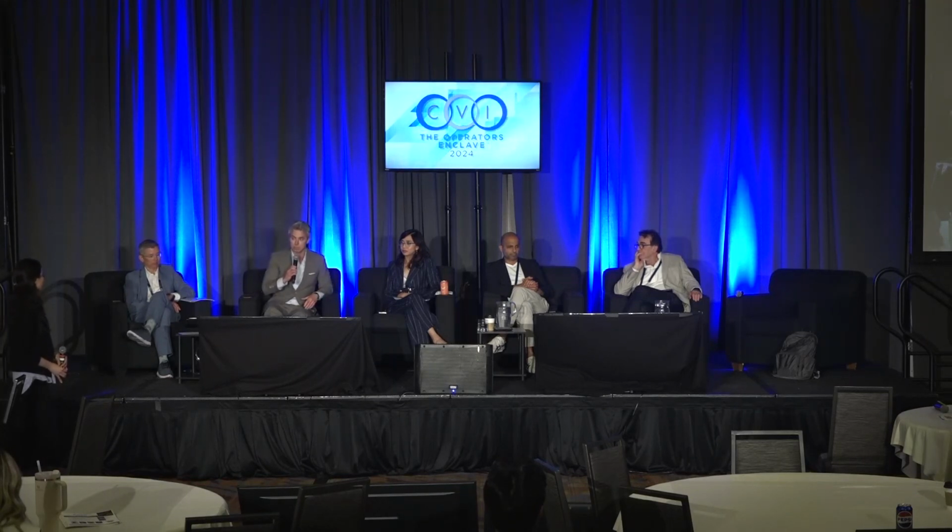And the other thing is that I hope everybody was paying attention, because the workup that occurred afterward with the angiographic images of the lower extremity was very well done. For those who don't do endovascular intervention, having that information with DSA acquisition imaging is very, very important to understand what to go after. And even if you're not an endovascular interventionalist, you can get these images while you call your colleague and put them one step ahead of the game. Well done.